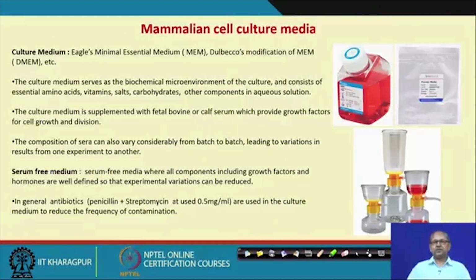Then after that, if you check that the media color is red, meaning phenol red, it is okay, and there is no turbidity, it is fine. If turbidity is there, then there is microbial contamination. So, you have to discard it. You have to be so meticulous that no contamination should be there.